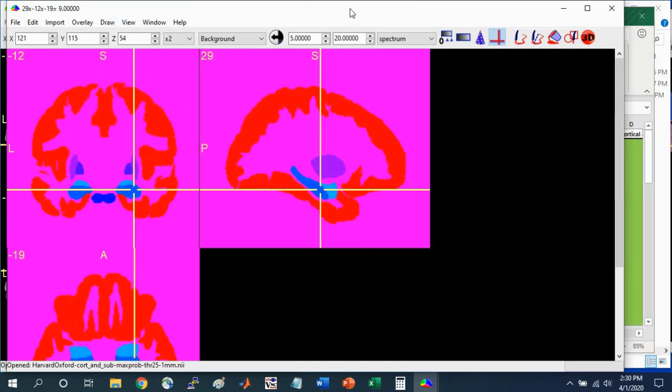We've gone over how to use atlases to identify brain regions and how to use atlases that I've included in these materials. You can use these concepts for whatever standard atlas that you work with. As long as it's in a nifty file format, you can load it up into MRI-Cron.